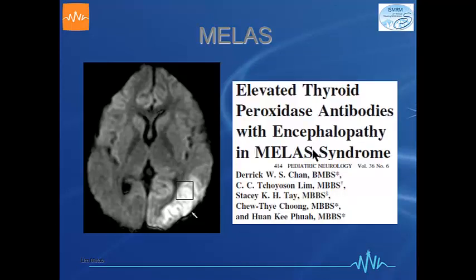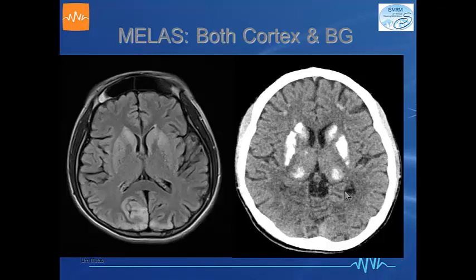And these patients, like I said, can be great mimics, and one of these mimics and difficult conditions that we do see is Hashimoto's encephalopathy, and there's a lot of debate as to what that might be. And this patient presented as what we thought was that, but we realized that there was something odd about this patient, and we did the spectroscopy, and we were able to reach the correct diagnosis.